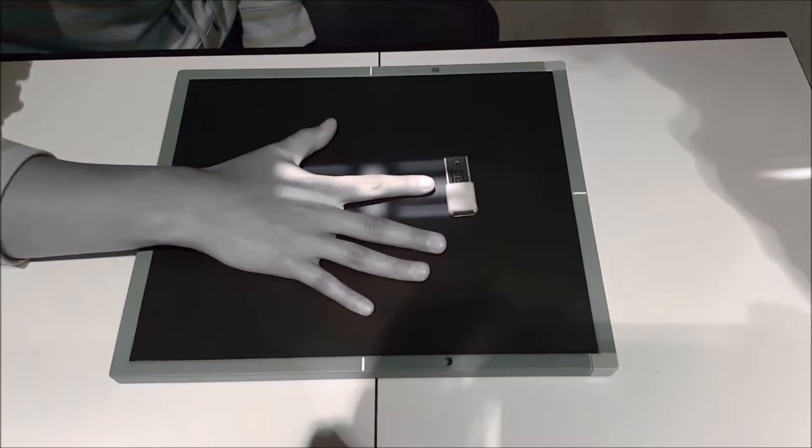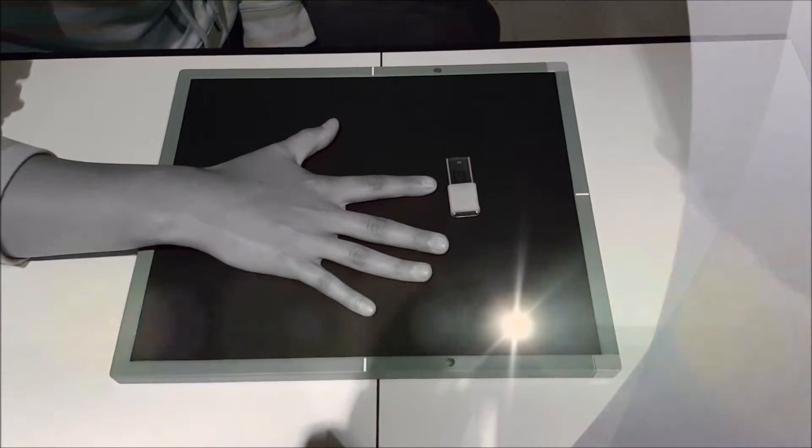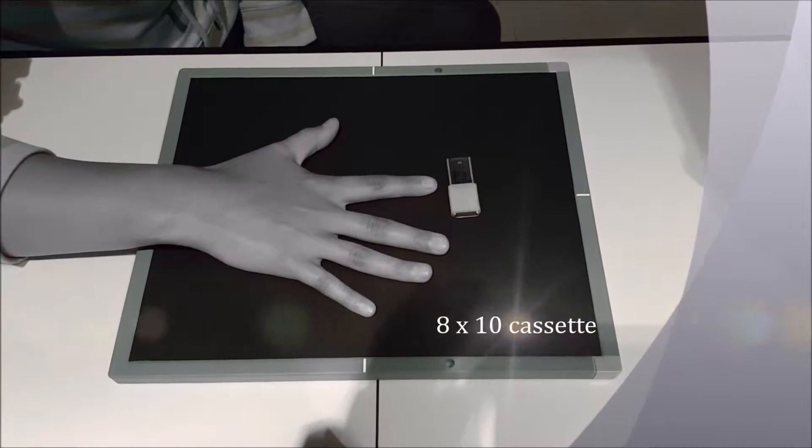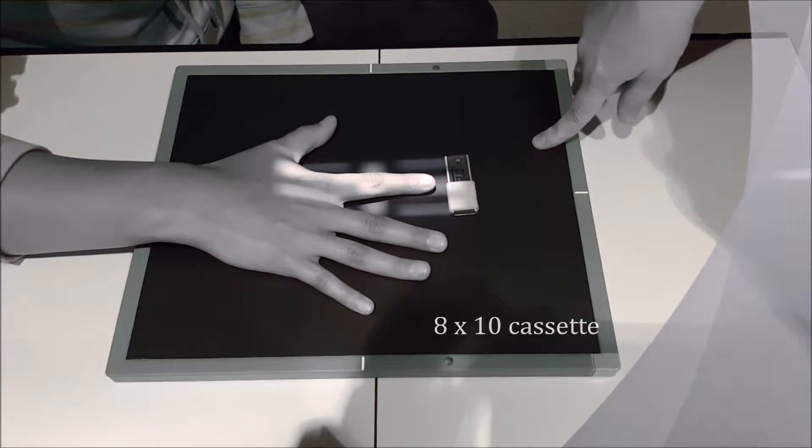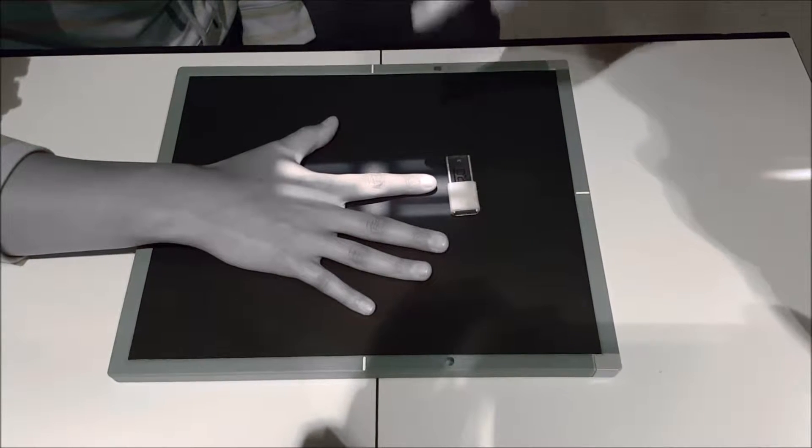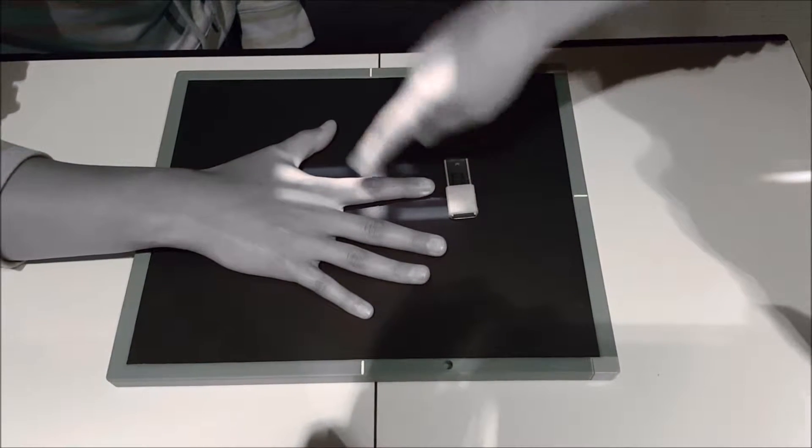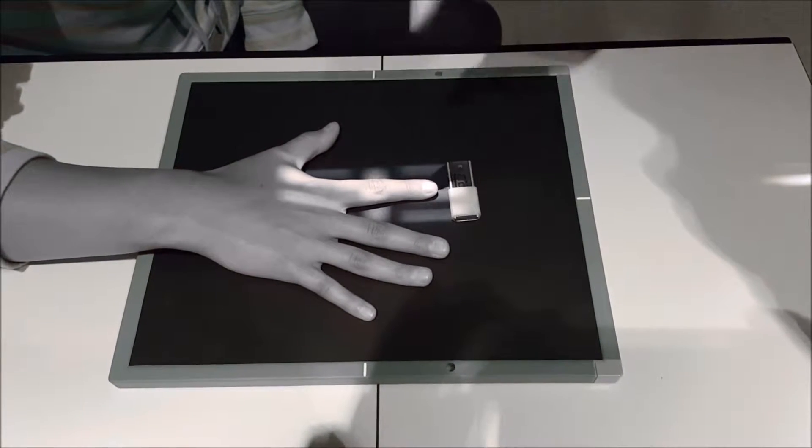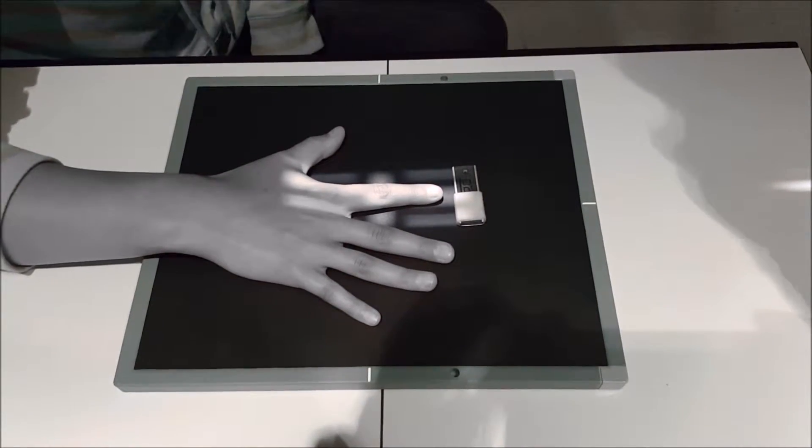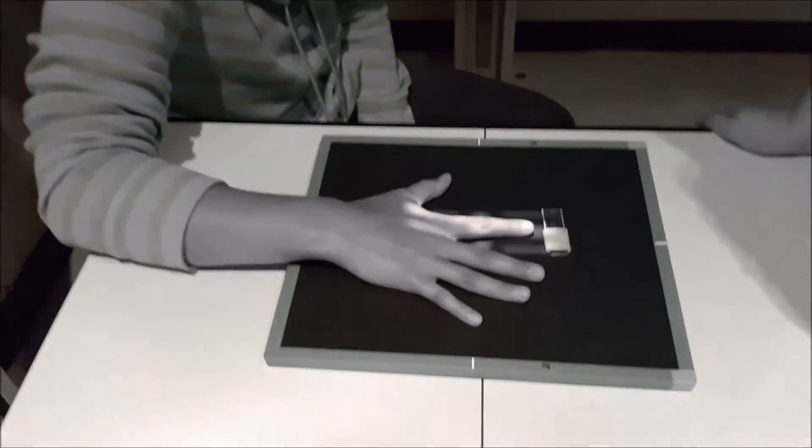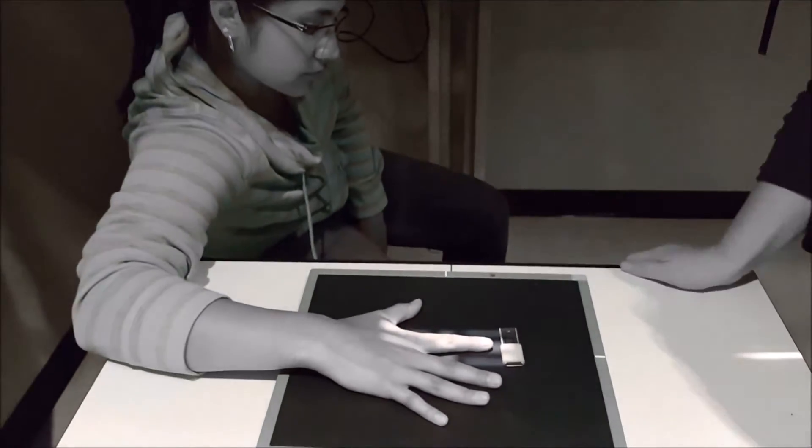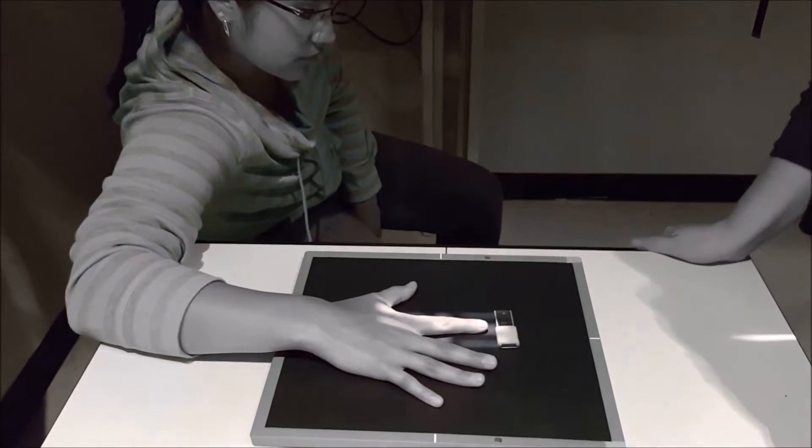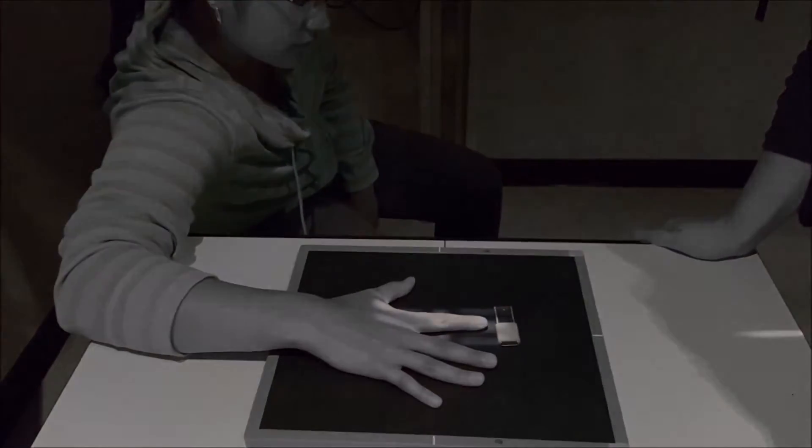We are still at 40 inches. We absolutely could use an 8x10, however we don't have any, so this is a 10x12 cassette. Perpendicular to the PIP, place your marker up at the top. Forearm needs to be on the same plane so you have your patient scoot out. Obviously you'll shield, no respiration.